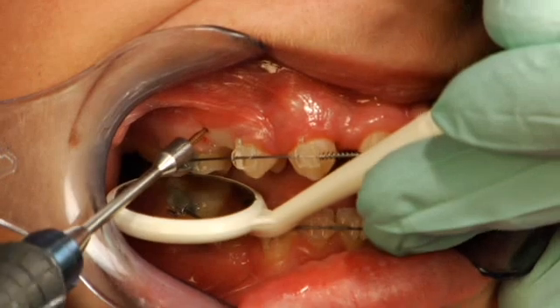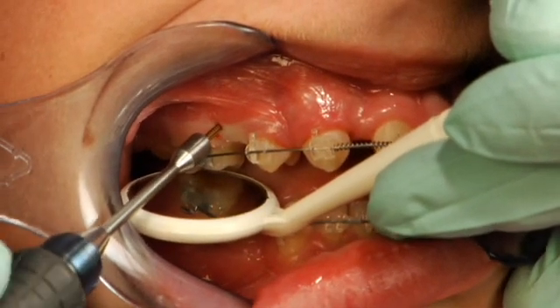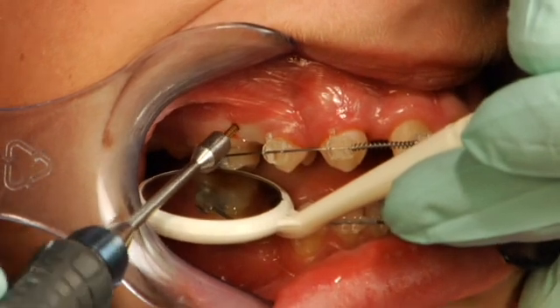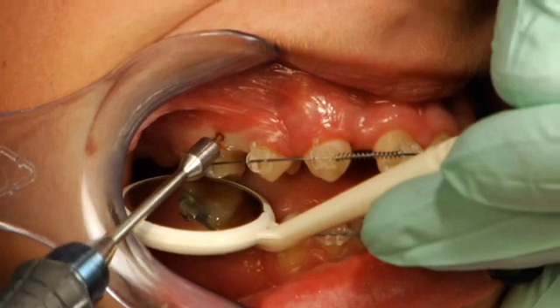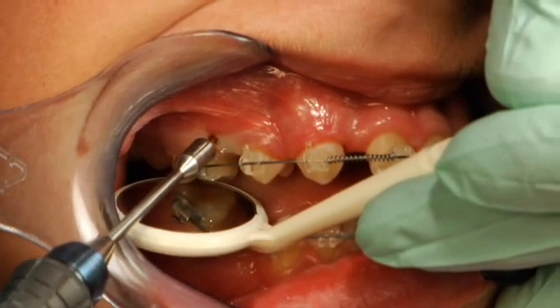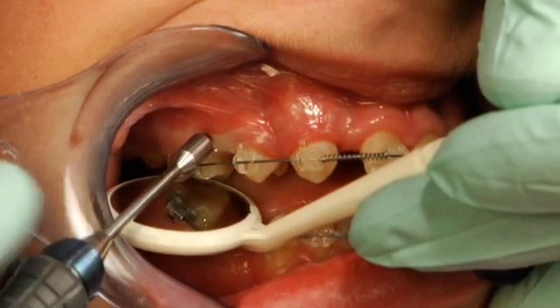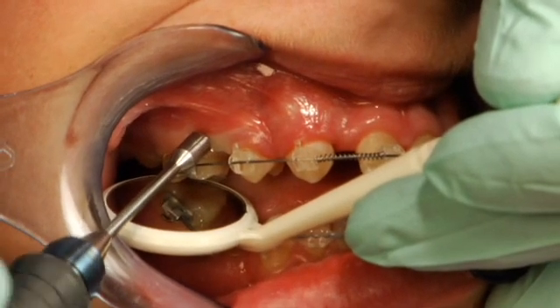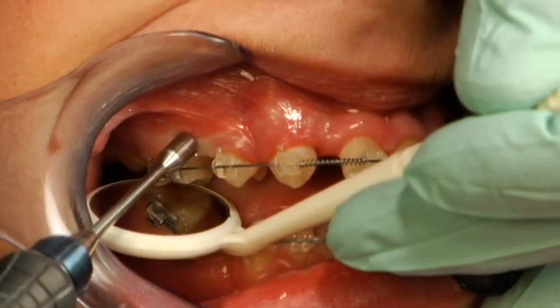Okay, now we're just going to press — you'll feel a little pressure. At this point I'm applying pressure to initiate what I call the catch. The threads have actually captured the cortical plate, and now I've relieved some of the pressure and I'm letting the rotations of the screw threads pull the mini screw into position through the cortical bone.